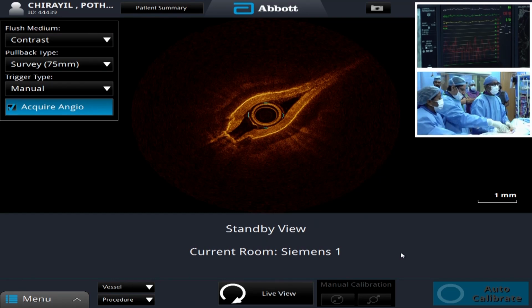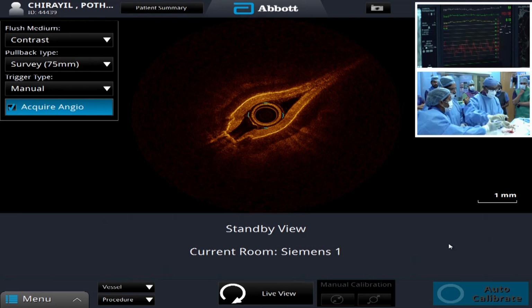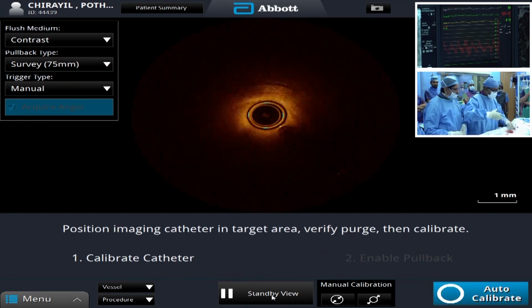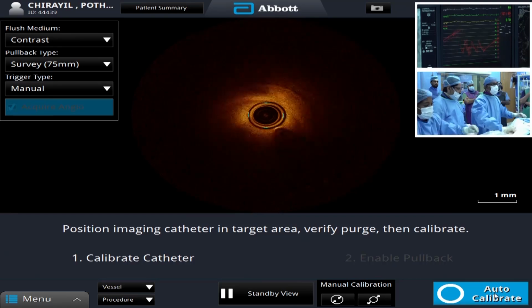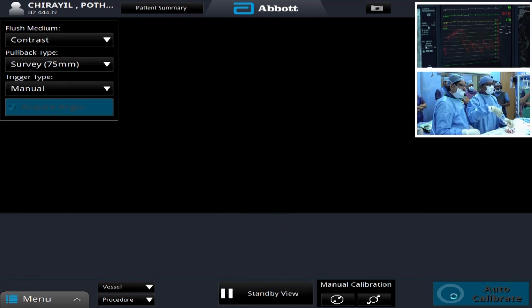Shall we come closer? Yes, crossed. Are you ready? I'll ask you to activate. The guide is okay.